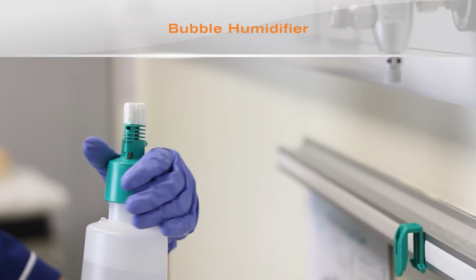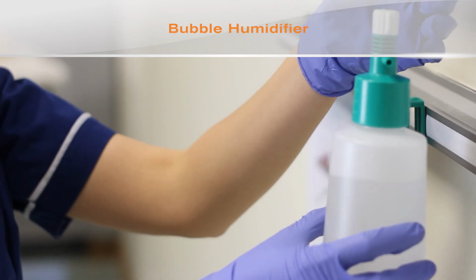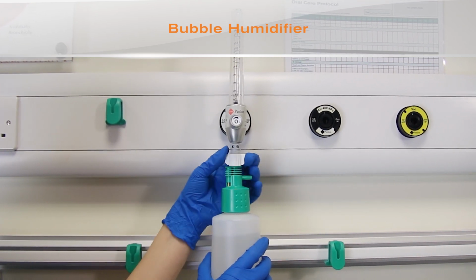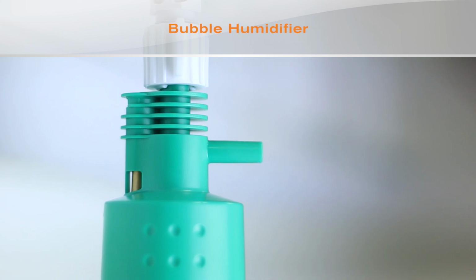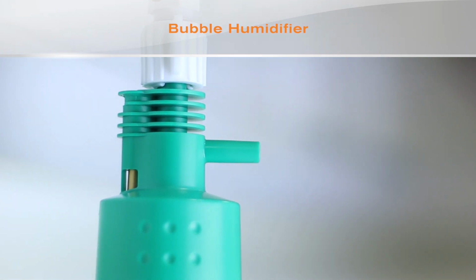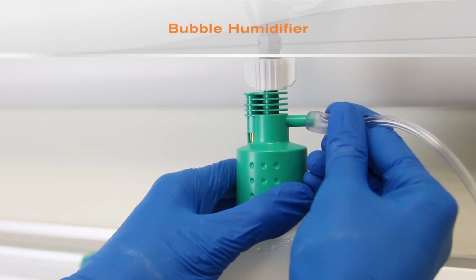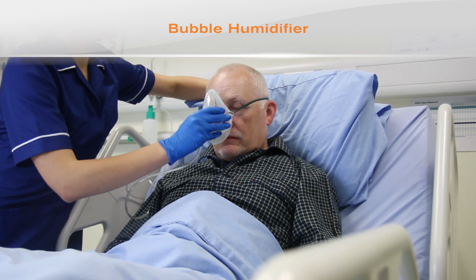Fill the bottle with sterile water using an aseptic technique and fit to the humidifier head. The humidifier should then be attached to the flow meter. To test the pressure relief valve, adjust the flow meter to 4 litres per minute and occlude the outlet. Verify that the relief valve operates within 5 seconds. Reset the oxygen flow meter to the appropriate flow for the patient. Attach the oxygen tubing to the bubble humidifier and the delivery device and fit to the patient.